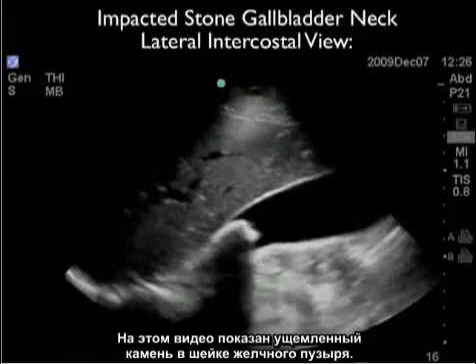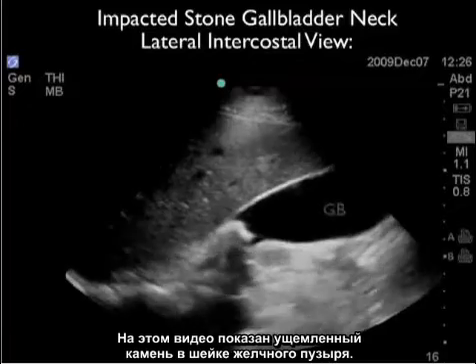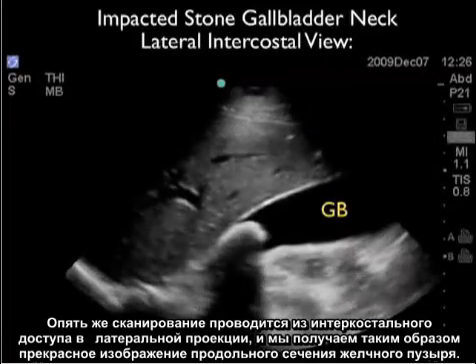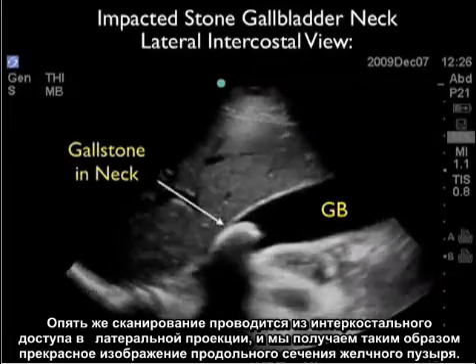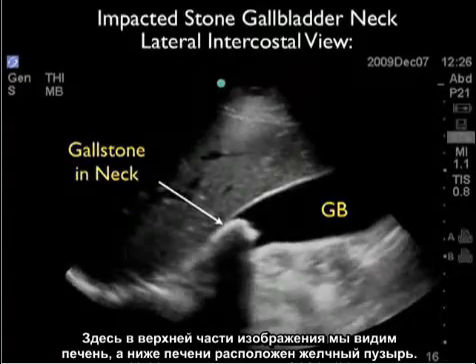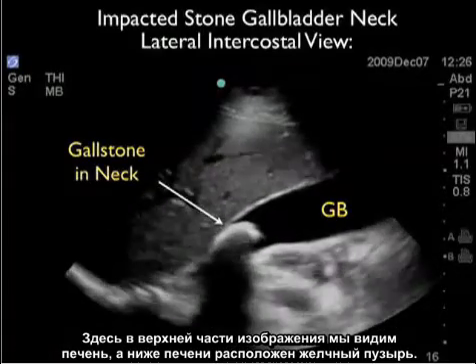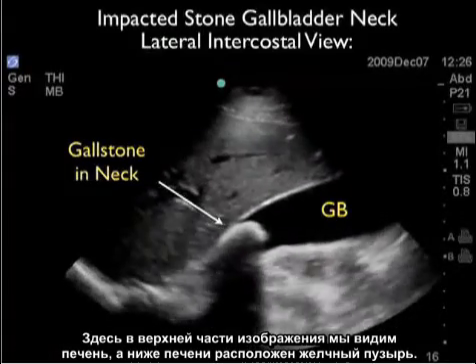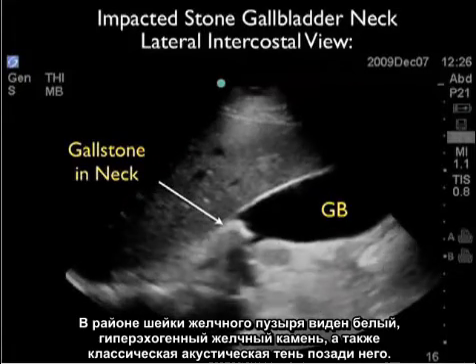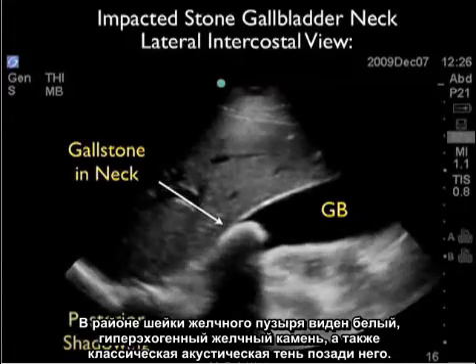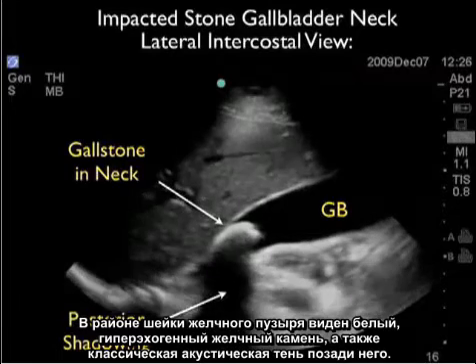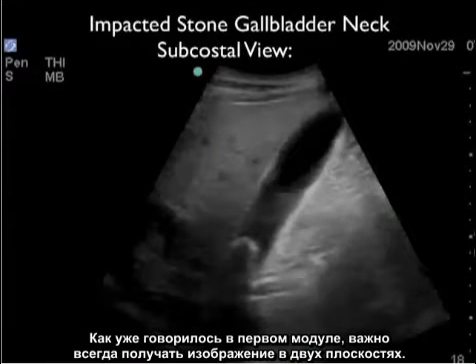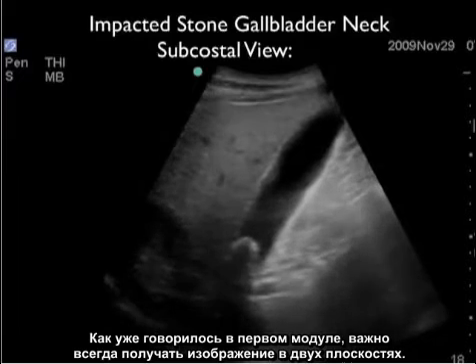Here's a video clip showing an impacted stone at the gallbladder neck, again taken from the lateral intercostal view that gives great long axis views of the gallbladder. We see the liver at the top of the image and the gallbladder inferior to the liver. Towards the neck of the gallbladder, we see a white hyperechoic gallstone with the classic posterior acoustic shadowing. As mentioned in Module 1, it's always important to look at the gallbladder in two orientations.